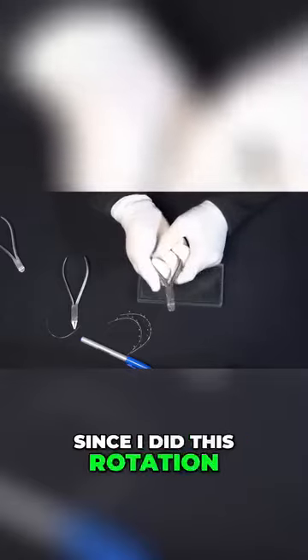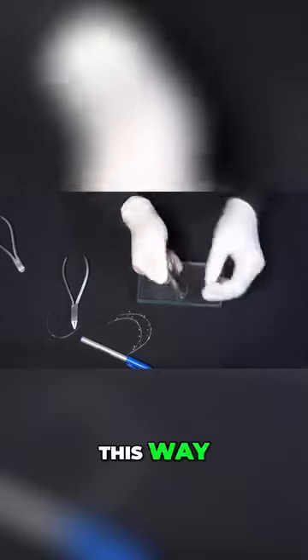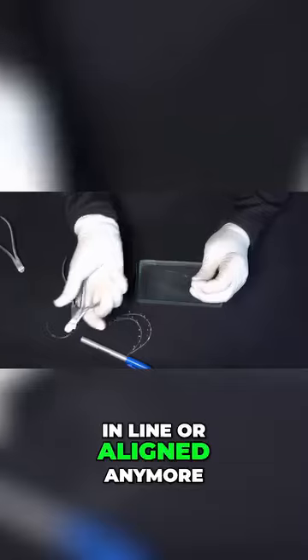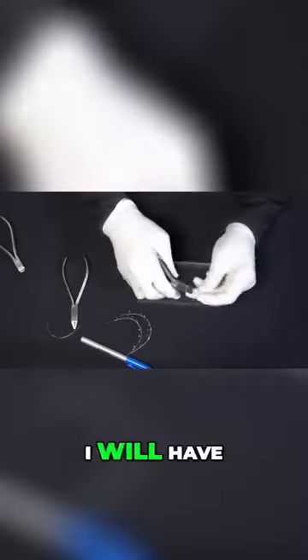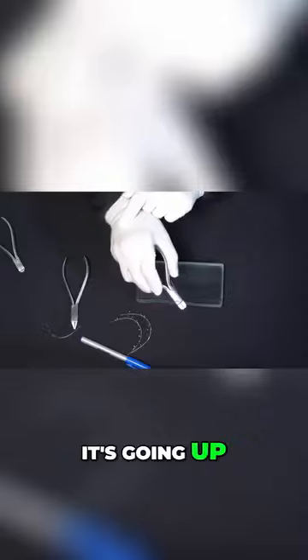Since I did this rotation, I really twisted the cross section of the rectangular wire this way. And from this point on, the posterior segment will not be aligned anymore with the center of the plier — so I will have it going up. As you can see here, it's going up.